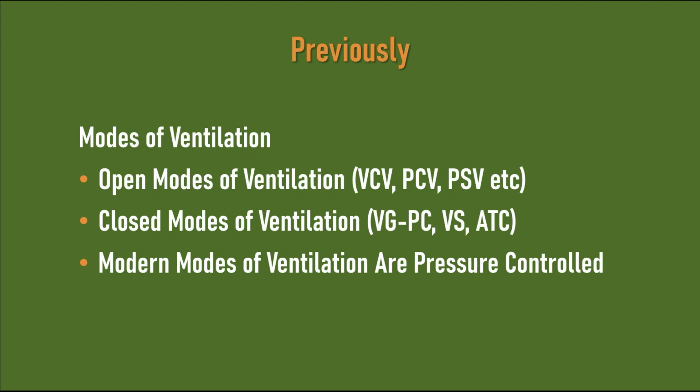The ventilator senses patient activity using high quality flow and pressure sensors and then dynamically makes adjustments to flow and driving pressure. This may be achieved from breath to breath in the case of volume guaranteed pressure control or volume support, or within breaths in the case of automatic tube compensation or PAV+. These are all pressure controlled modes. This tutorial specifically looks at proportional assist, or more correctly titled proportional assist with load adjustable gain.